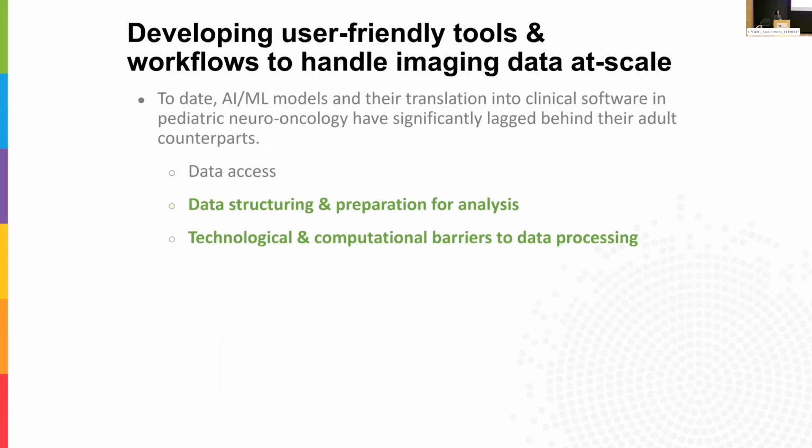So I'm going to be primarily talking about Flywheel and some of the efforts that we currently have in structuring imaging data, preparing it for analysis like semi or automated segmentation for CBTN data in particular, as well as how we're addressing some of the barriers in technology and computation.